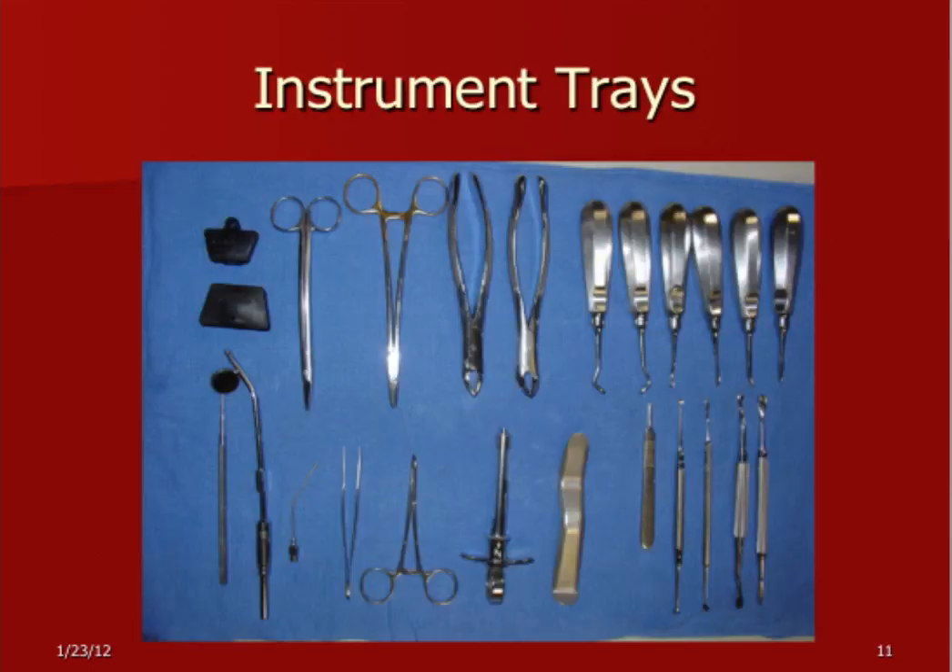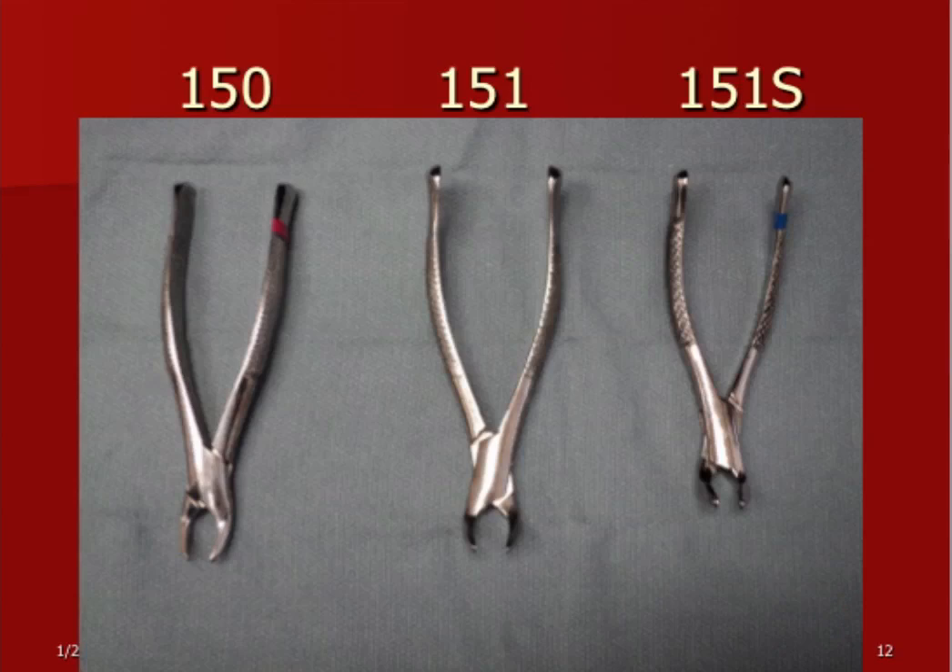We'll run through some instruments quickly. This is our basic standard tray. It's hard to get 100% of your instruments there — if you do, you'll have three or four trays worth. I usually get about 90% of what you think you'll need for a complex procedure, and then the last 10% you can plan based on the particular patient's procedure. These are some standard forceps: the 150, 151. I like the 151S, which is a smaller one — very small, got a sharp angle on it. It's pretty nice for working on third molars where you have hard access getting into the back of the mouth. It gets into tight areas and while it's short on torque, it's a very effective instrument.